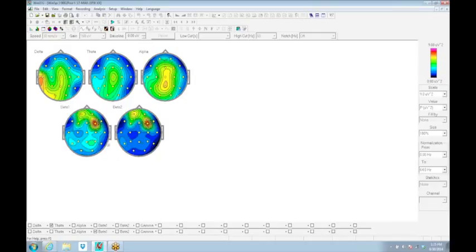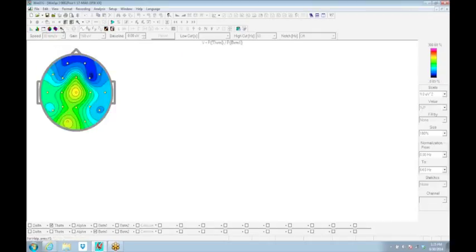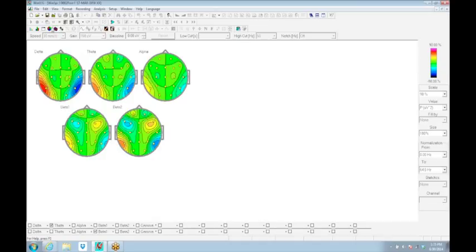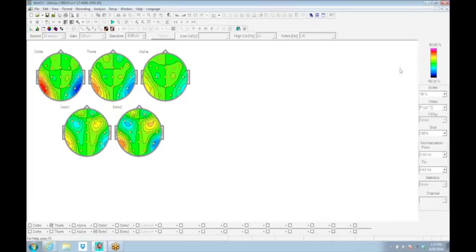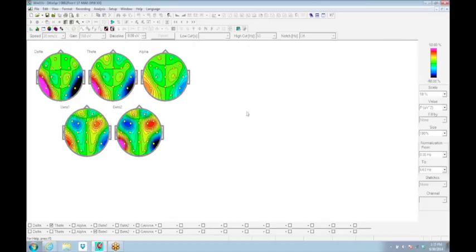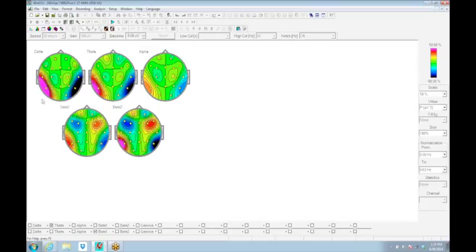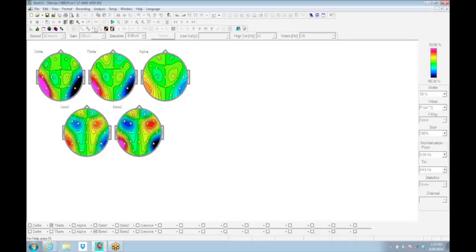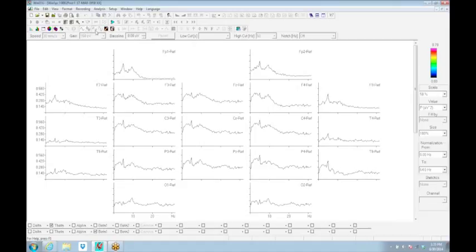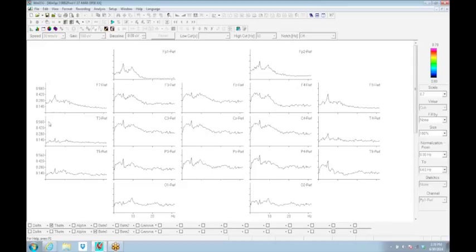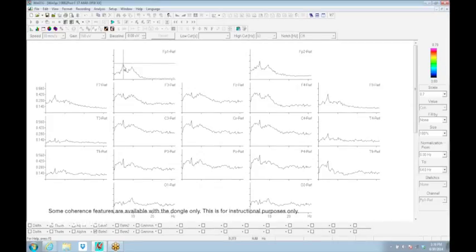Even individuals interested in gamma can have gamma if they define it within that. This gives you mapping. This also gives you symmetry. This is for asymmetry. Symmetry is left, right. Usually you adjust this with the thumb wheel to the 50%. Asymmetries 50% and greater are sometimes viewed as being more significant. Here are primary asymmetries being driven by the slow stuff that's artifactual over on the left temporal area. That wasn't anything terribly significant within this. In the display, we also have average coherence as a display.